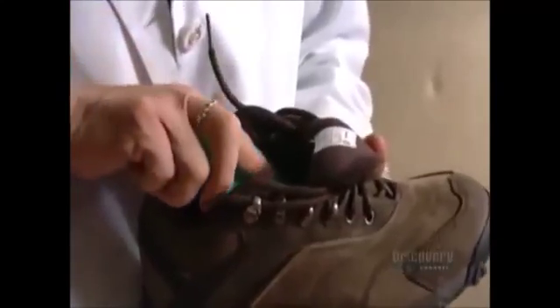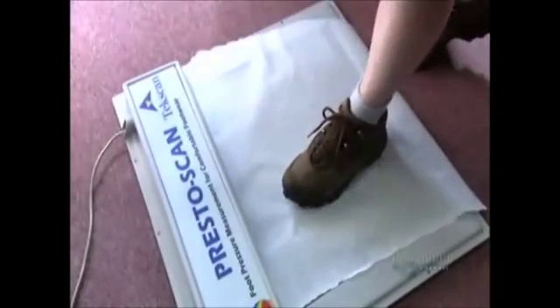To ensure the orthosis delivers the goods, the patient redoes the key test while wearing it. Remember that scan showing red areas? They're gone now because the patient's feet now bear her body weight equally.